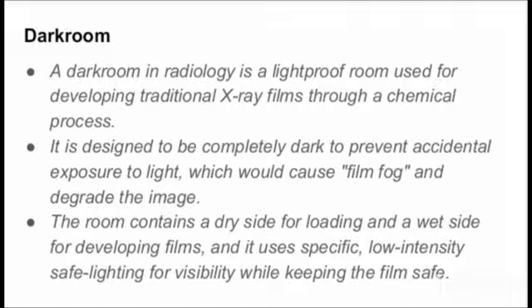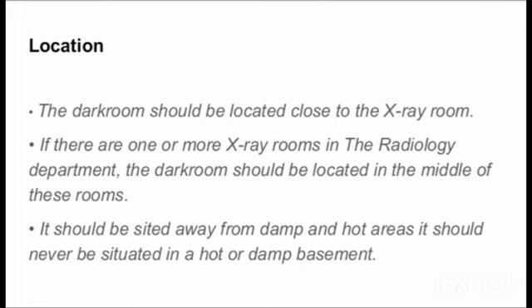Darkroom. A darkroom is a radiology department room which is a light-proof room that is used for developing the traditional X-ray films through a chemical process. It is mostly done in a manual method. It is designed to be completely dark to prevent accidental exposure to light, which may cause film fogging and can also damage the films. The room usually consists of a dry side for loading and a wet side for developing the films.